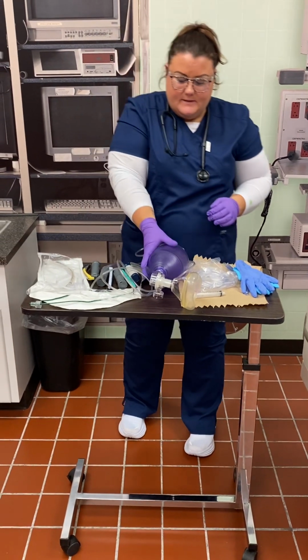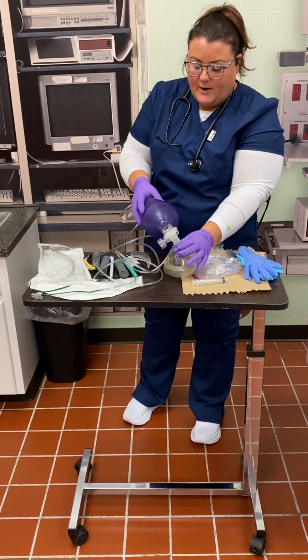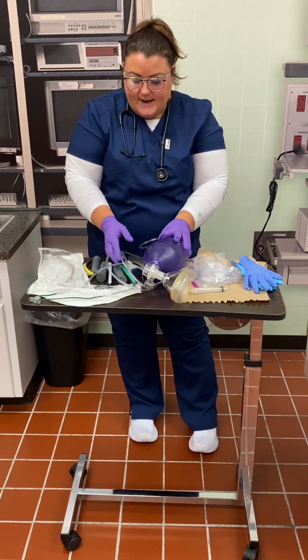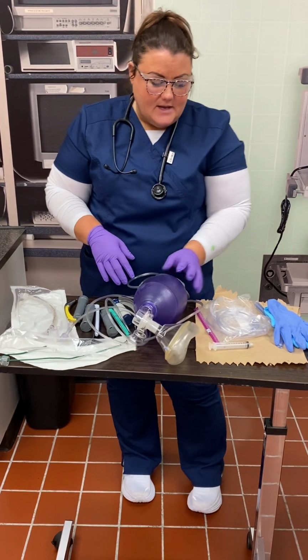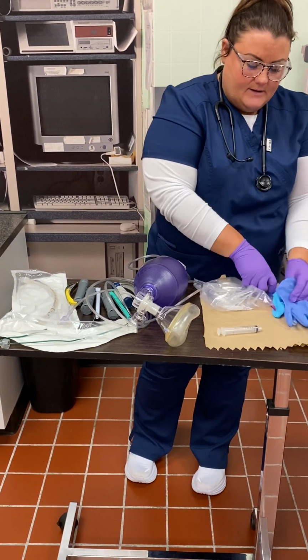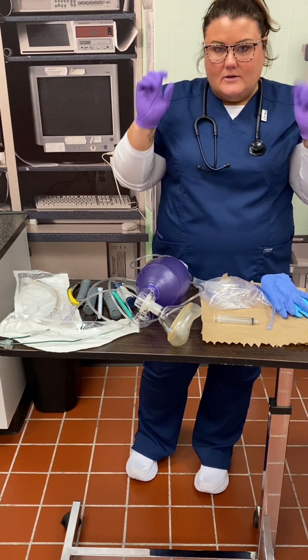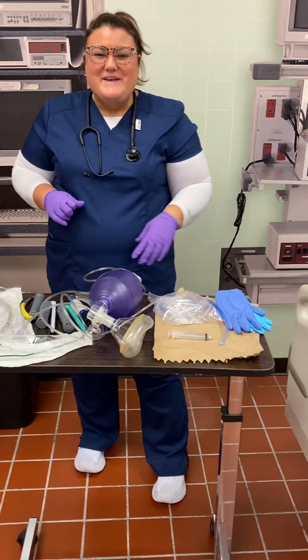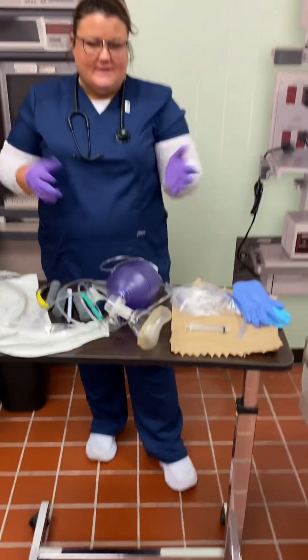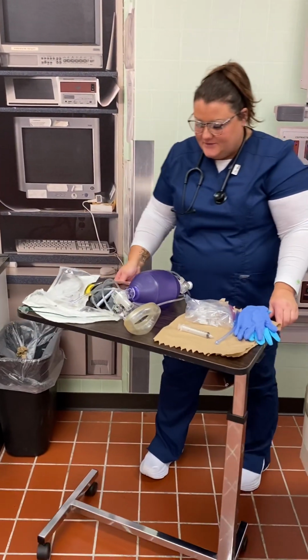And test my equipment, checking my ambu bag, make sure the mask is inflated, make sure that the valves are working properly. I would make sure that I have my code box on standby just in case we need to re-intubate my patient. I have a nasal cannula, got a yonker, my syringe, stethoscope, and goggles. And my paper towels, well, these would be my towels, but for when I get done extubating him, that way he doesn't get it all over him. So I would take these off, throw them away, go in my patient's room.